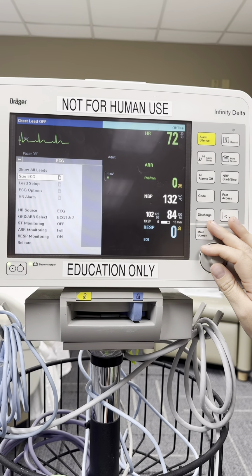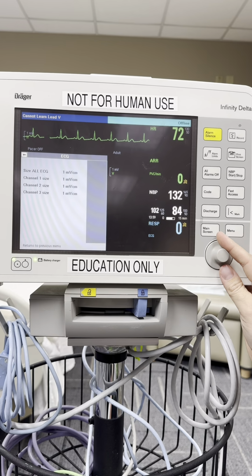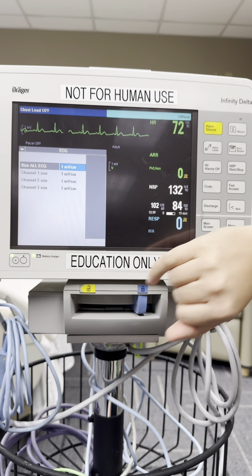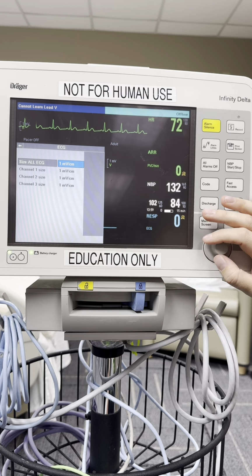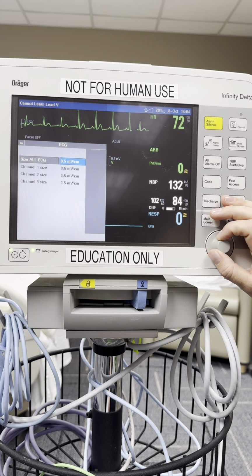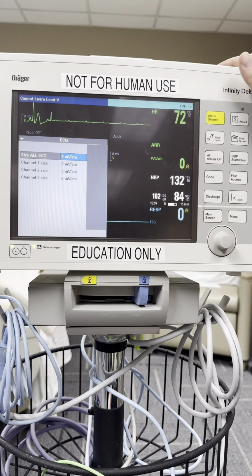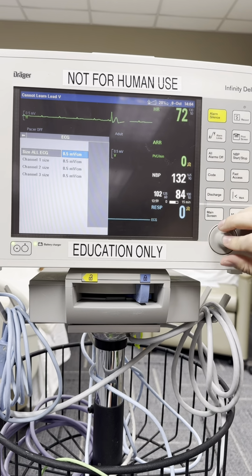The size ECG, this is how you change the gain. So if your patient is constantly alarming asystole and you know that they're not, this is how you change the size of it. Usually you'll change all of them, or you can just change per lead. But if you change all of them, the smaller the number, the larger the waveform, and the larger the number, the smaller the waveform. So like this one might alarm asystole because it can't see the little beats. So you'll want to change that size.